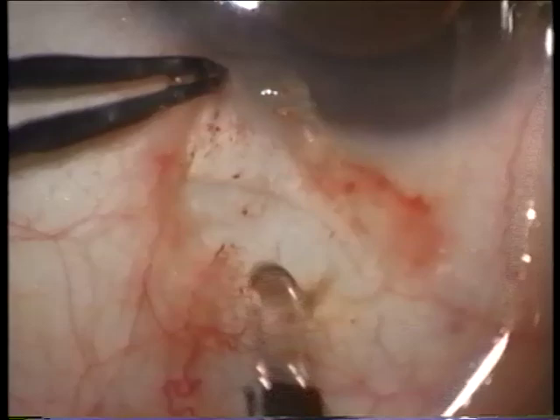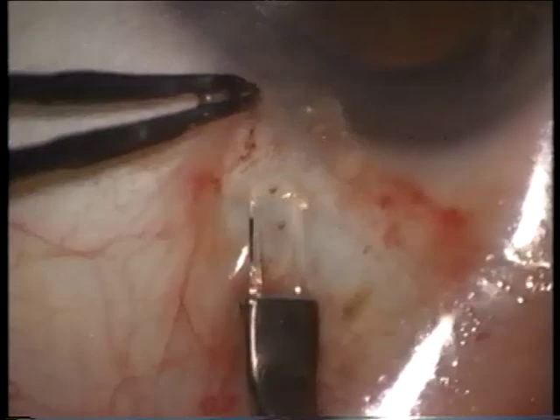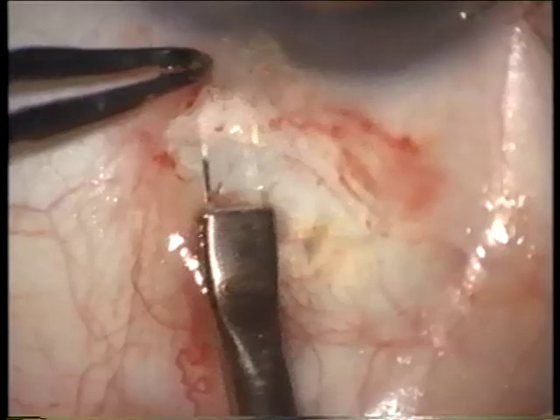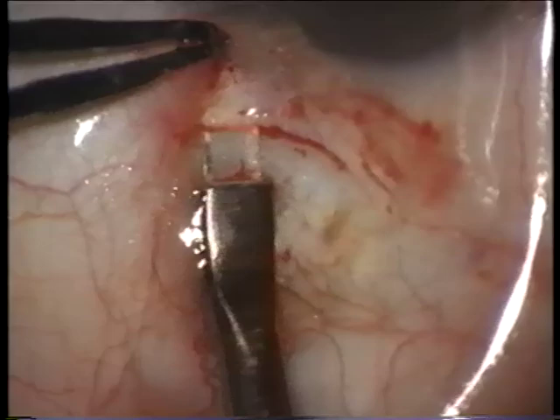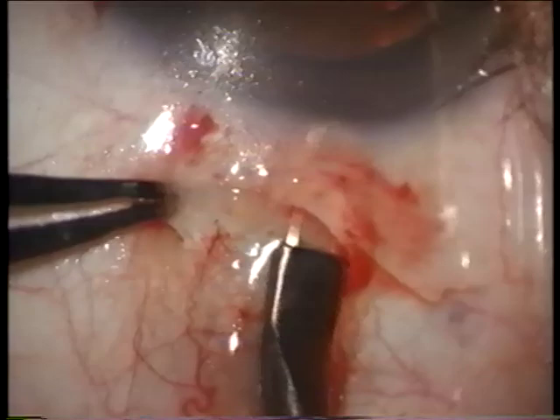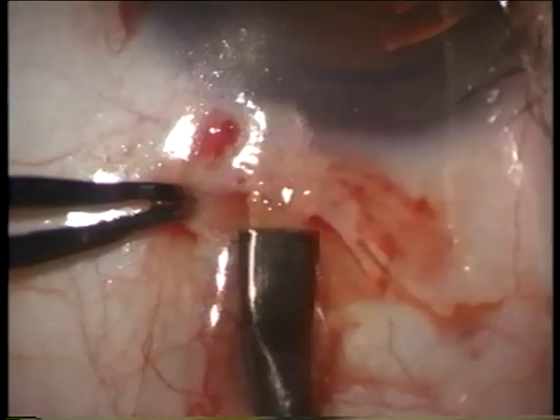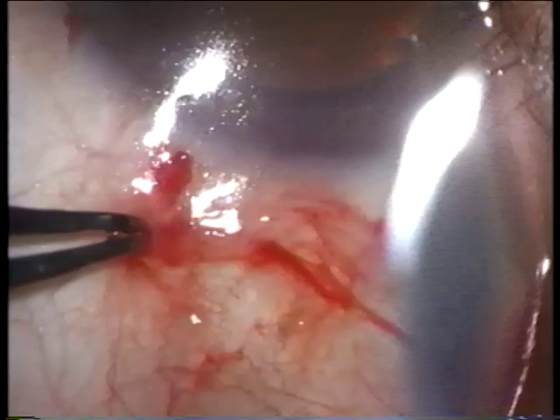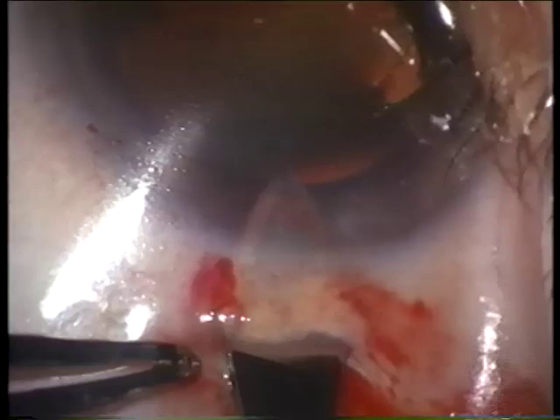In fact, the paper I'll be giving — we did a little retrospective study and found that our standard deviation as well as the mean induced flattening was lower with the scleral tunnel than the clear corneal at two to four months. Maybe it's my learning curve with corneal incisions. I like to use a temporal incision always if there's against-the-rule astigmatism. Conversely, I like to use a superior incision if there's with-the-rule astigmatism, to reduce rather than possibly add to the astigmatism.